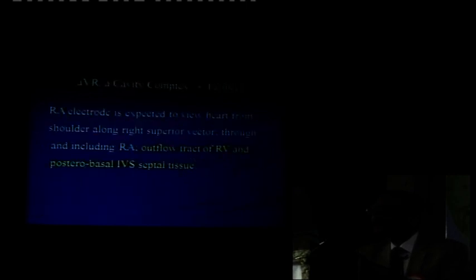Previously, in the beginning, the ECG was only of 3 leads, which was done by William Einthoven. Later on, the ECG became of 6 or 9 leads when V1 to V6 were invented, and now it is this 12-lead ECG, with the introduction of these 3 leads, Goldberger's leads, which make the 12-lead ECG. An important concept which I want to deliver here is the concept of cavity complex.